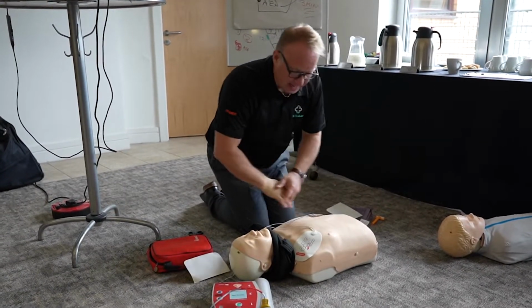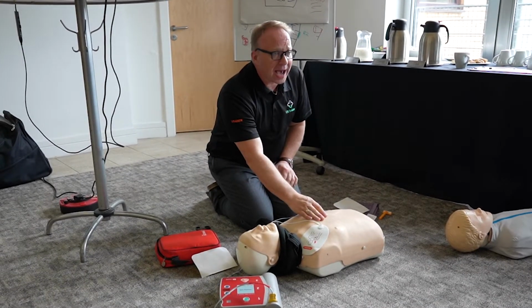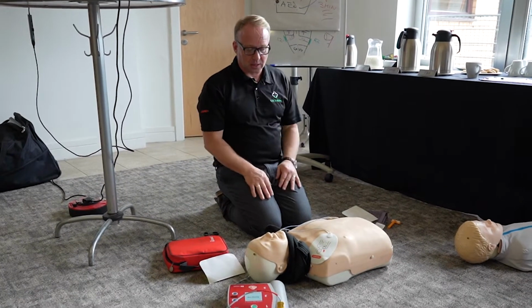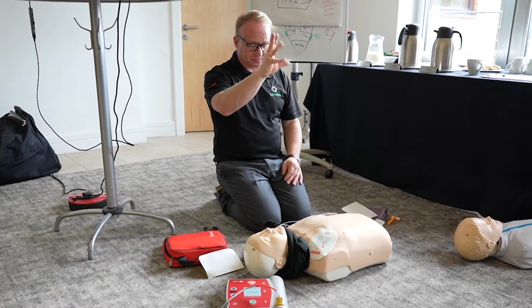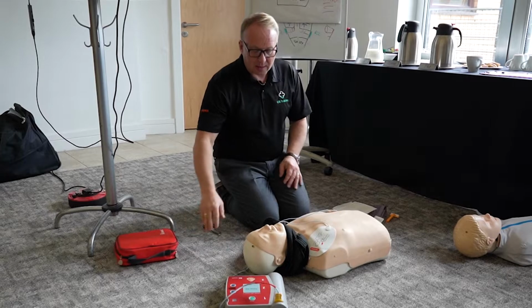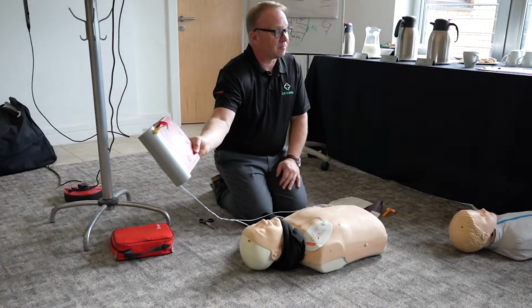Analysing heart rhythm. Do not touch the patient. If I'm touching them, who's it going to analyse? Me. So don't touch. Shock advised. Charging. Heart's in fibrillation. Stay clear of patient. Stand back. Deliver shock now. Press the orange button now. You can see where you need to press it.